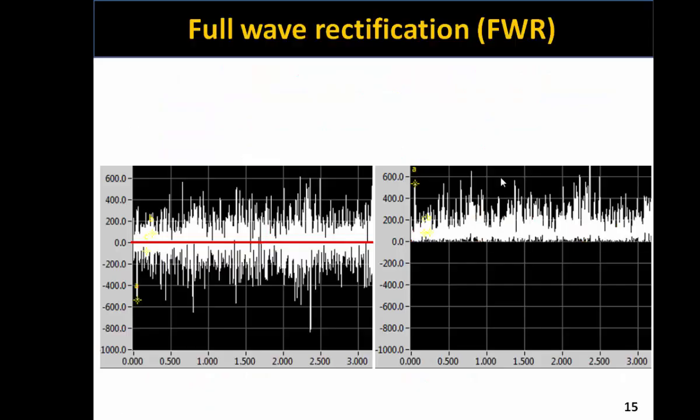So once we produce the overall EMG and record the EMG signal, to begin to use it to examine things such as the magnitude of a muscle contraction, whether a muscle is activated more than another muscle, and so forth, we have to start quantifying that signal. The simplest, most common step that's used is something called full wave rectification. On the left-hand side here you see a typical raw EMG signal, and we have a deflection. We have a number of positive values.